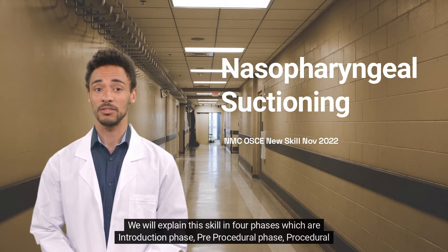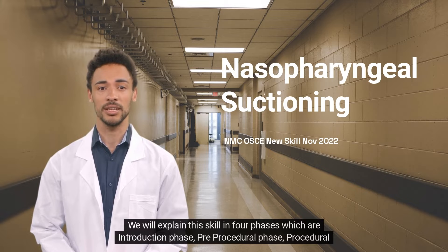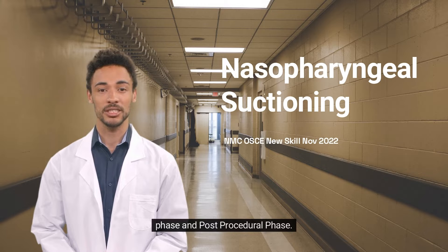This skill is explained in four phases: the introduction phase, pre-procedural phase, procedural phase, and post-procedural phase.